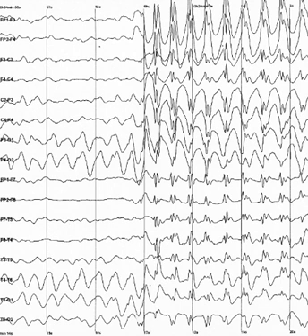EEG has several limitations. Most important is its poor spatial resolution. EEG is most sensitive to a particular set of postsynaptic potentials, those generated in superficial layers of the cortex, on the crests of gyri directly abutting the skull and radial to the skull. Dendrites, which are deeper in the cortex, inside sulci, in midline or deep structures such as the cingulate gyrus or hippocampus, or producing currents that are tangential to the skull, have far less contribution to the EEG signal.